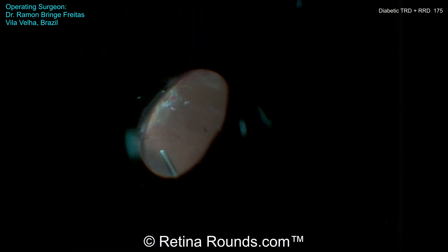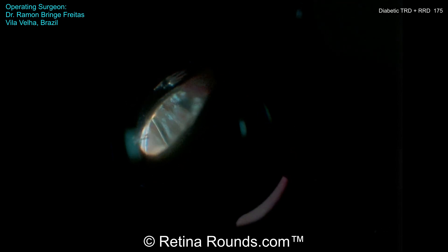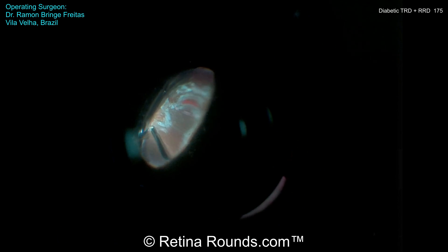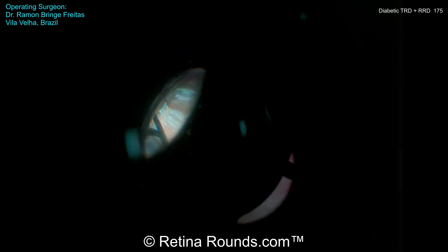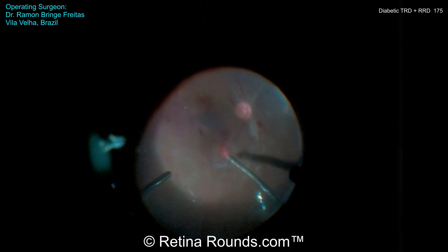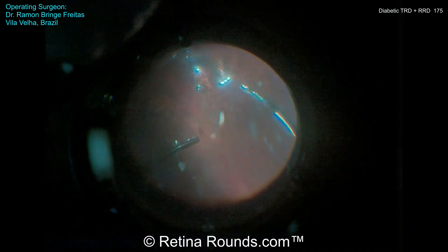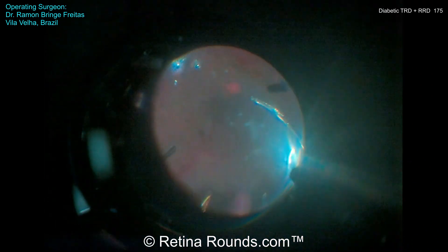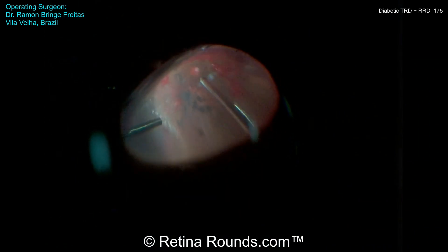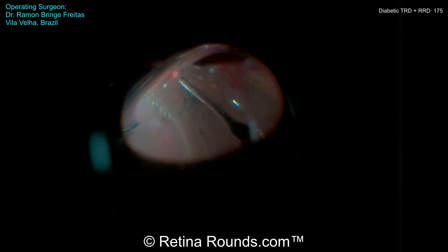He's aspirating over the optic nerve to remove any fluid on the pre-retinal surface, and now going back to the laser to augment some of the retinopexy — particularly around the anterior side of the breaks, and especially around the posterior edges where retinal takes were inconsistent due to residual subretinal fluid. Applying laser retinopexy around the iatrogenic retinal break and around the posterior break along the supratemporal arcade, but not getting good takes because there is still residual subretinal fluid. It would be very important to use a soft tip to drain the fluid through those retinal breaks to completely flatten the retina and allow for better laser uptake.